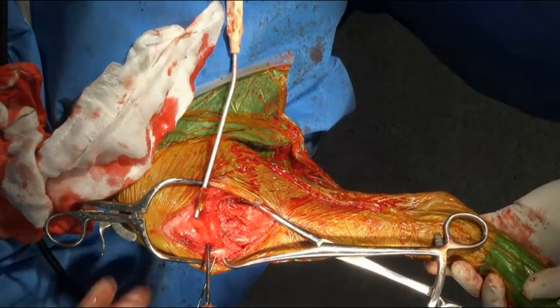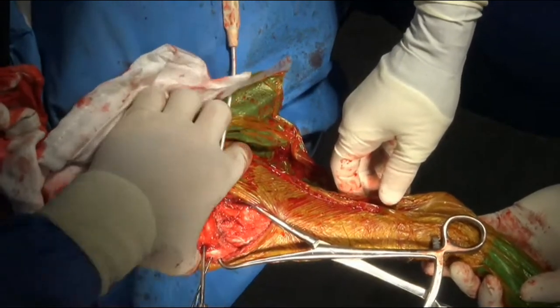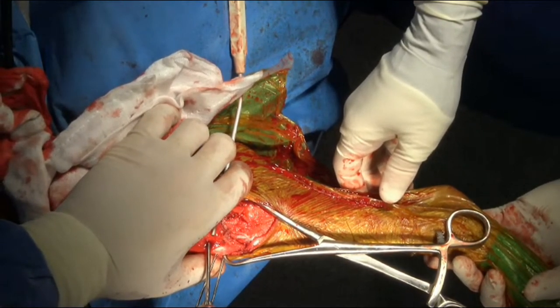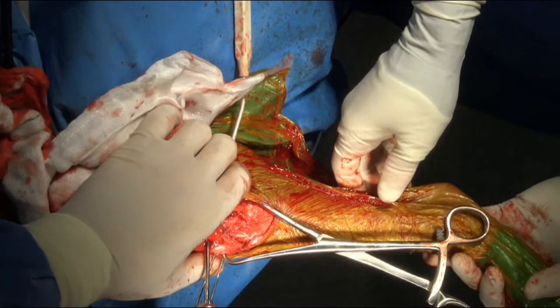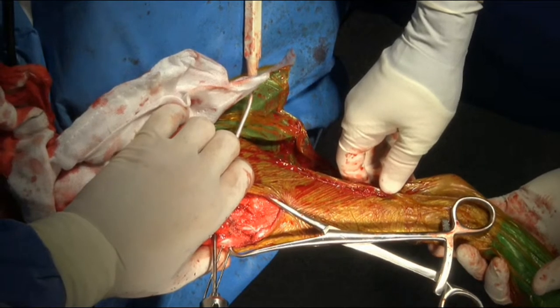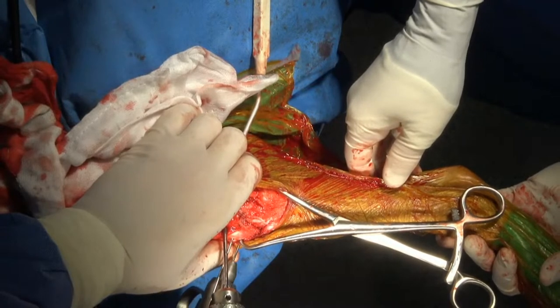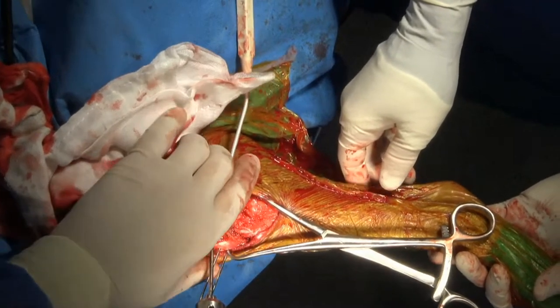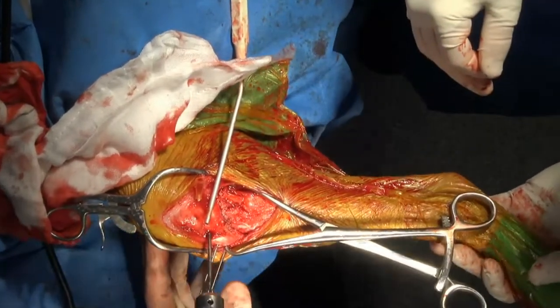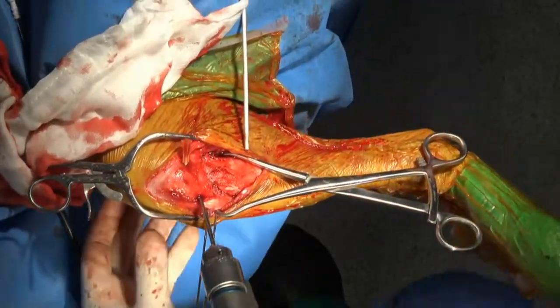So this second pin is going to go basically parallel to the first. And the second one is really just to be a bit of extra security to hold everything in place while we put our headless compression screw in. Okay. So I think that's looking pretty good. I'll triple check my alignment on that. Yeah. I'm happy with that.